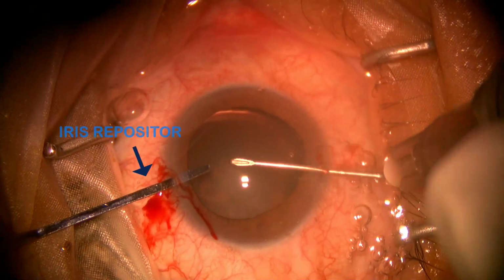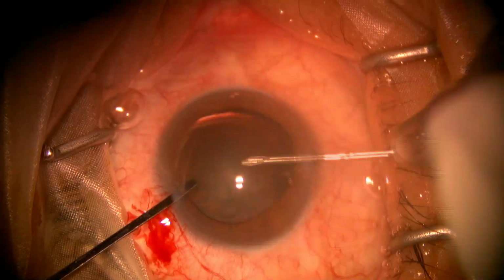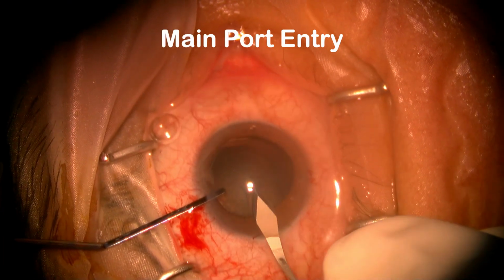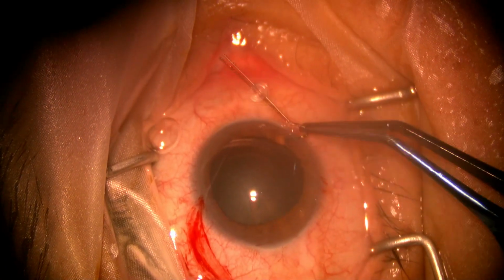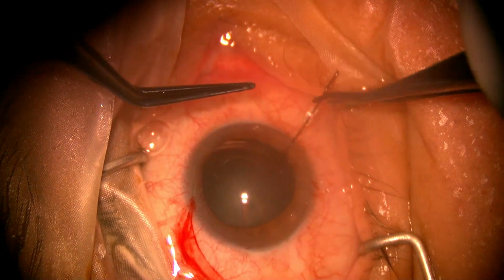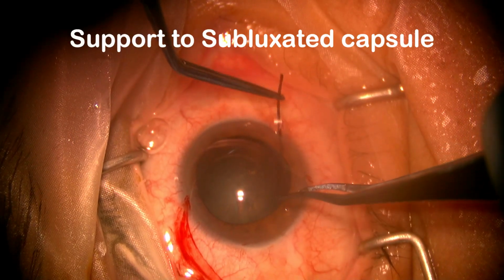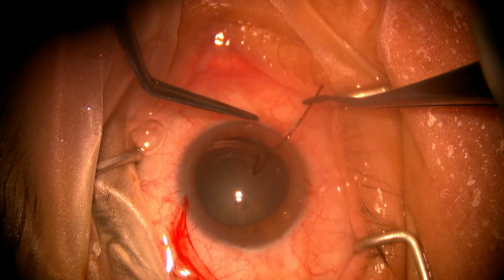Continuous curvilinear capsulorhexis is being made with a 26 gauge cystiotome needle. Main port with keratome knife along with side port is created. Now we can observe that the capsular tension hook is being applied to the area of subluxation in order to provide support to the subluxated area of around 2.5 clock hours.